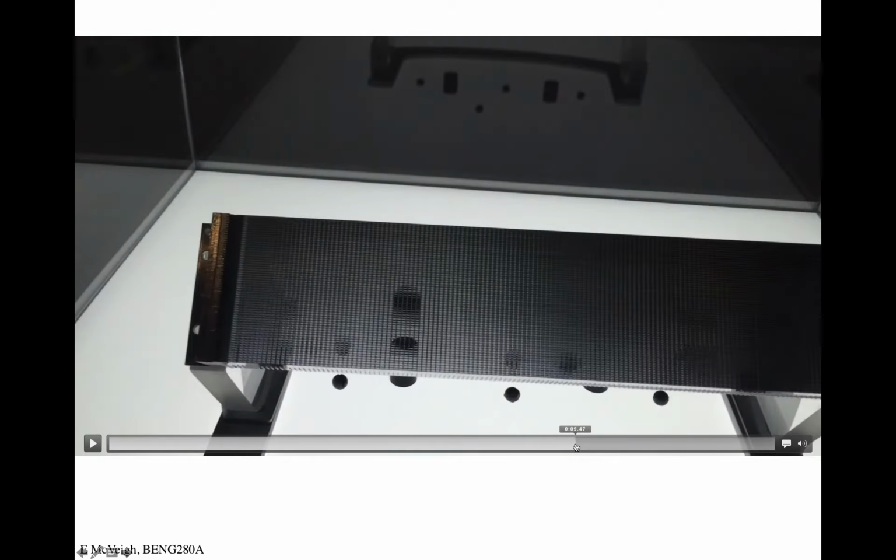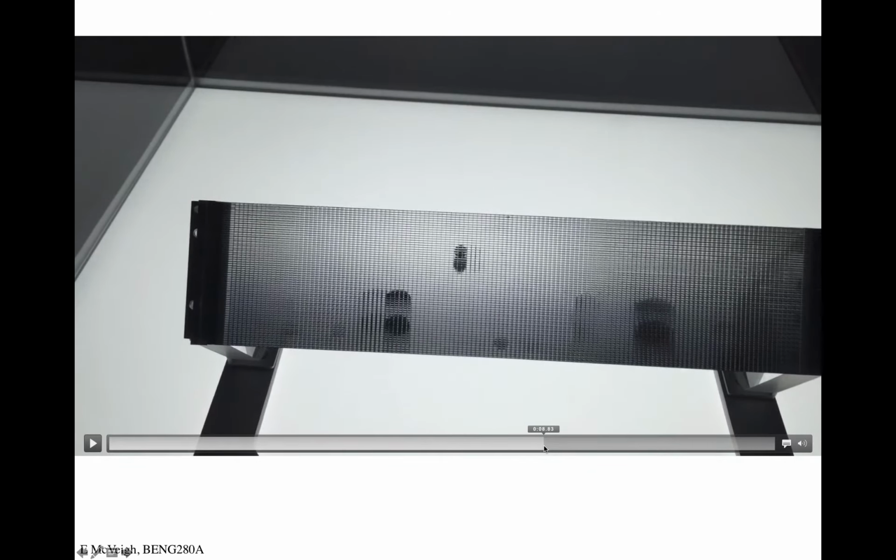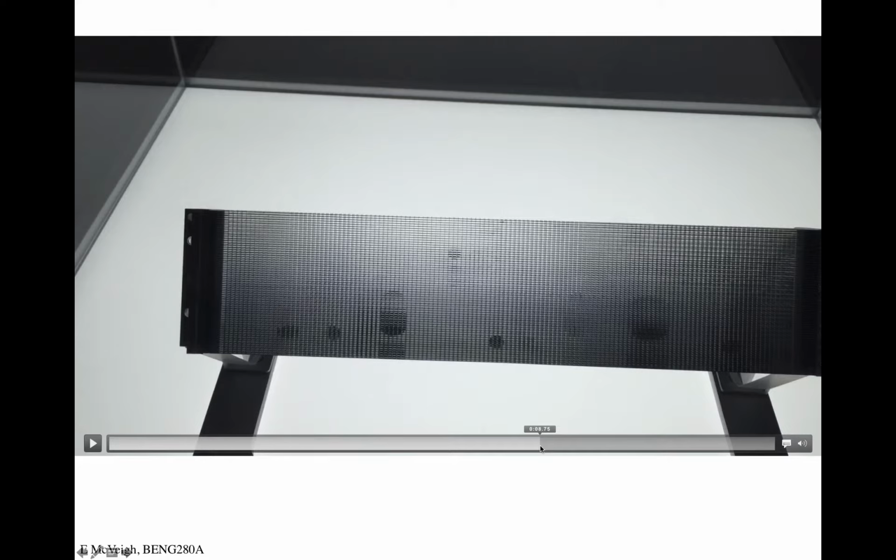There's these dark objects on a backlight, and then you tip over, and you can see that there's a primary image there, and if you get off to an angle, it basically disappears, right? When you're looking through, you can see there are walls and cells. You want just the X-ray coming through the cell cleanly. And if it's at an angle, it's going to hit a wall and get absorbed.